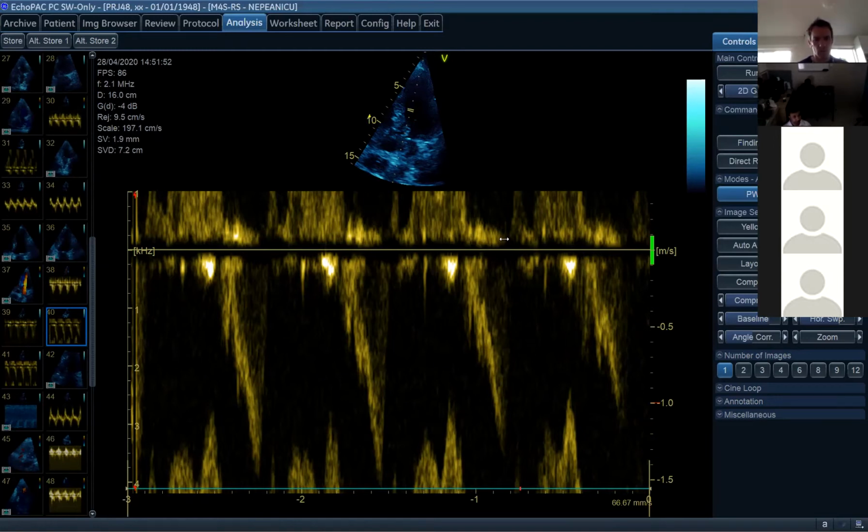And what's important for the hypovolemia is that that is different from LVOT obstruction. The LVOT obstruction comes from a septal knuckle or from systolic anterior motion of the mitral valve when someone's hypovolemic or even normovolemic with hypertrophic cardiomyopathy, or if they've suddenly got a dilated right ventricle that pushes the septum over. All of those things can cause the LVOT obstruction and the systolic anterior motion of the mitral valve. But when you've got that pulse wave Doppler box sitting in the ventricle, seeing these things can only indicate you've got this hyperactive LV systolic function causing some form of blockage. Beautiful.